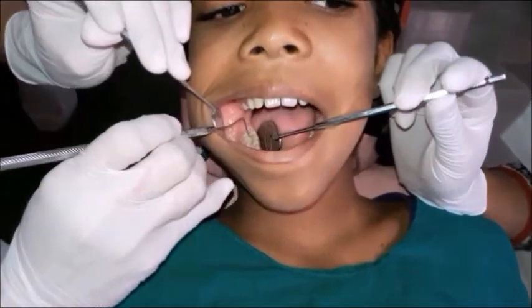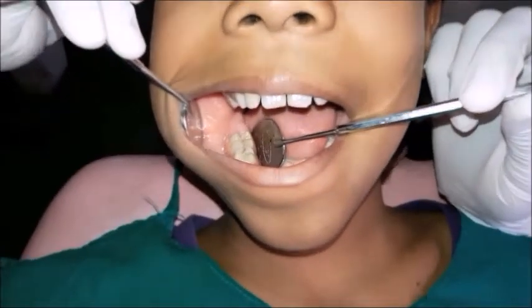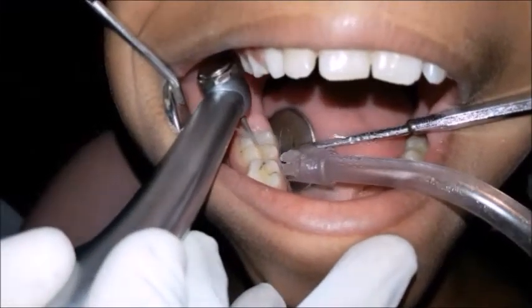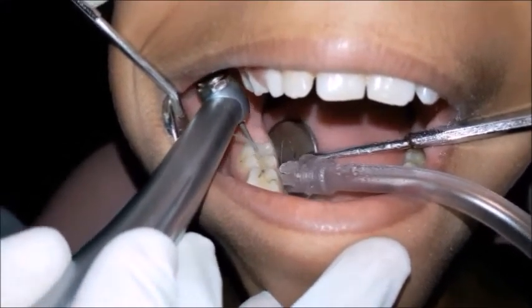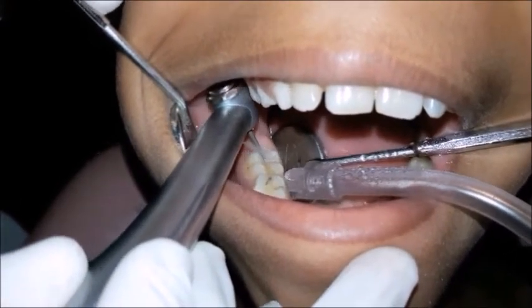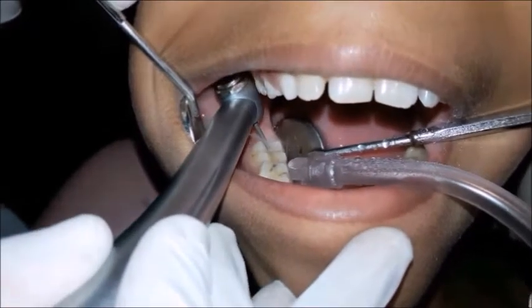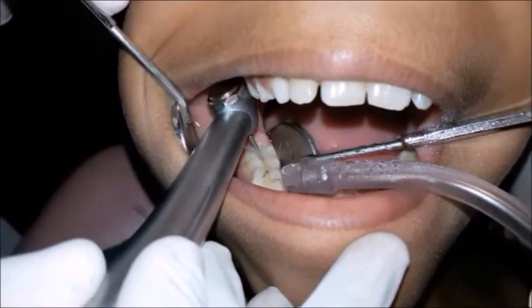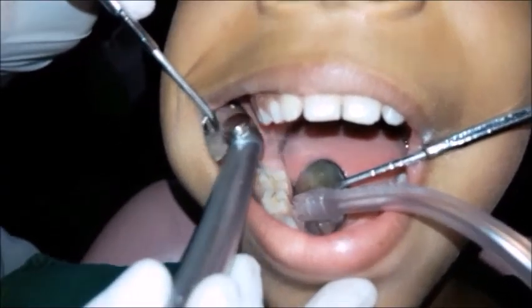As we can see over here, the presence of pit and fissure caries is the clear indication for the application of pit and fissure sealant. After inspection, we have to do fissurotomy using a fissurotomy bur, which is a 1/4 round bur. Fissurotomy is a conservative procedure to treat the initial pit and fissure caries by widening the fissures to decrease the chances of food lodgment. Proper illumination and vision as well as isolation needs to be maintained during the procedure.